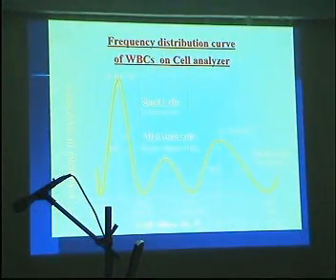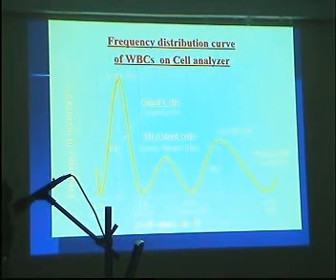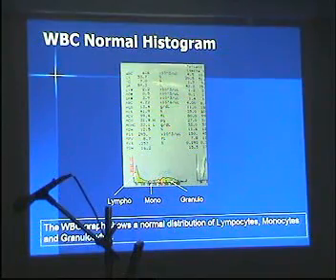Now, for the different sizes of WBCs, coming to the WBC histograms, you have lymphocytes which are smallest. Then the mid-size population is all three together, that means monocytes, eosinophils and basophils. And then come the larger cells, the neutrophils. A normal WBC histogram will look like this: a lymphocyte peak with a little flat monocyte and mid population, and then the neutrophils are seen on the right side.